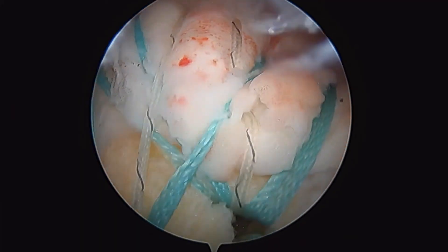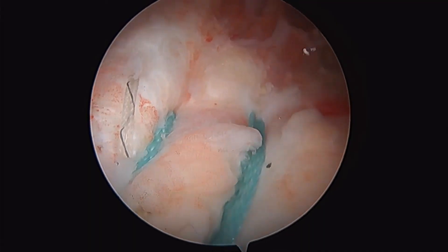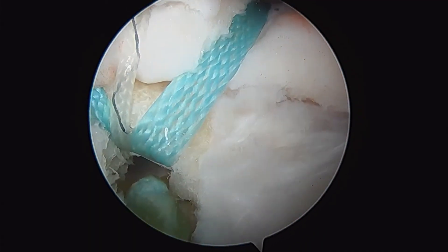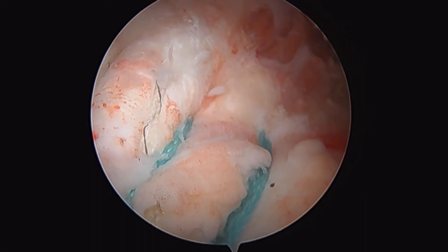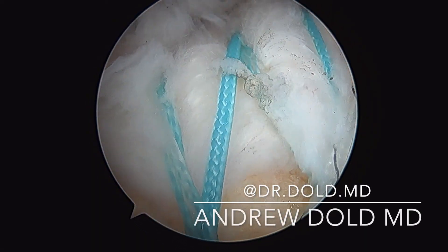Coming in lateral here, you can see a pretty decent look at our repair. That looks very good. We've re-approximated it down. There you can see the hollow architecture anchors in our lateral row. It's a good-looking repair here for a full thickness rotator cuff tear of the shoulder.